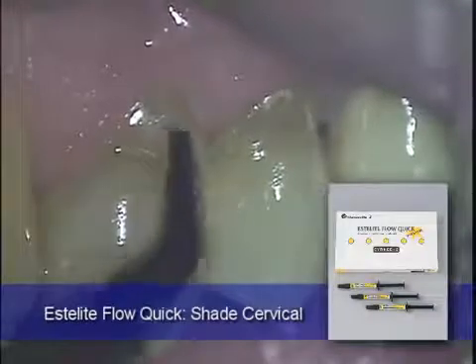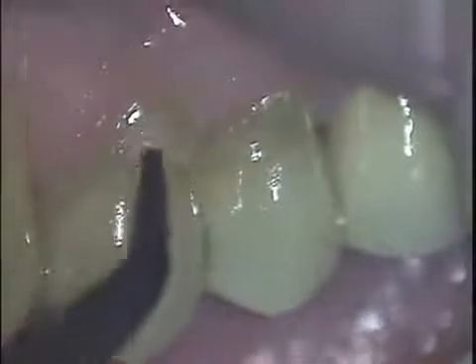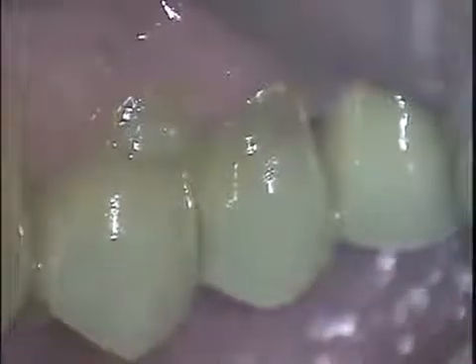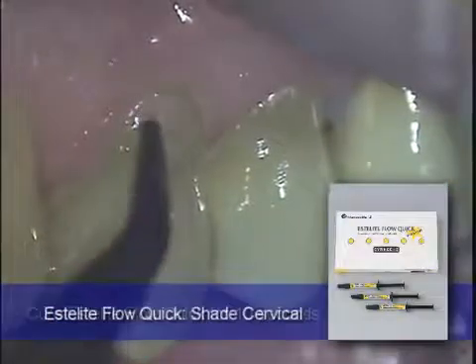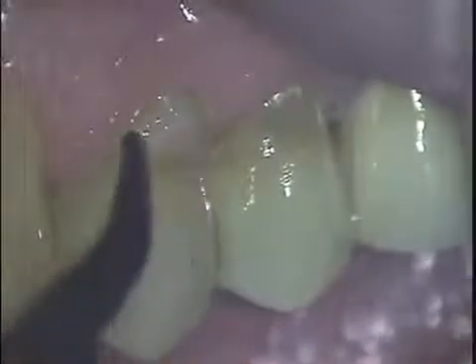The Estelite Flow Quick is placed incrementally in 2mm layers and light cured for 10 seconds each. In many cases involving Class 5 restorations, whether these are caused by abrasion or abfraction, these lesions tend to be in teeth that are often darker in shade and in older patients. Very often these can be restored easily using a single color called the cervical shade.